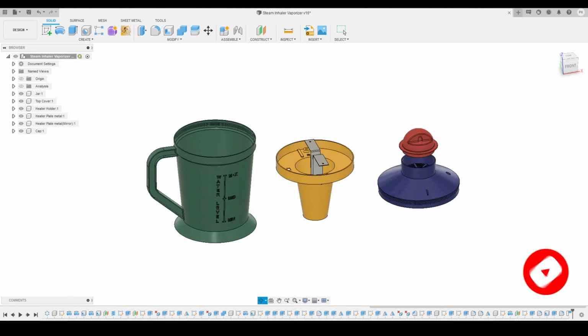Here you can see the canvas folder and this canvas. So what I will do, I will right click and click on calibrate, and I want to make sure that the scale is correct. So I will just, from top to bottom, make this canvas. I will give the measurement 115 millimeters. So here you can see it has been scaled in the correct scale.